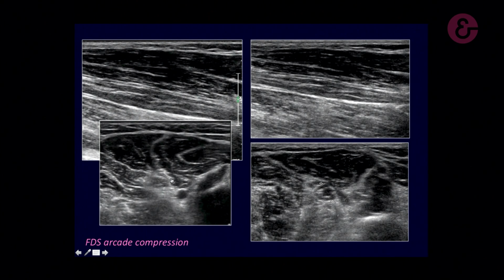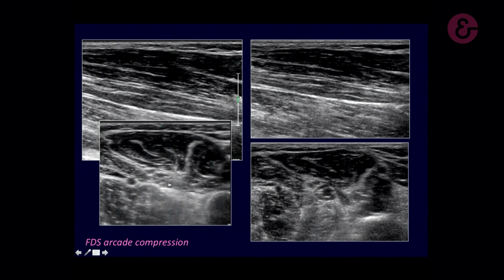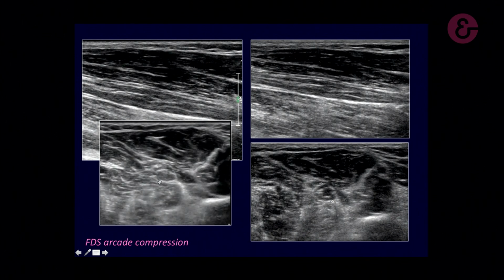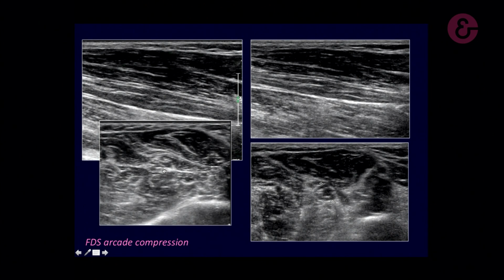And if I go a little bit slower, I see the nerve, which is normal over there. It is compressed over here by the muscle, flexor digitorum superficialis, swollen, and again, distally it is completely normal. So every time you do that, you have to compare to clinical findings. This is really necessary, the only thing that can work.